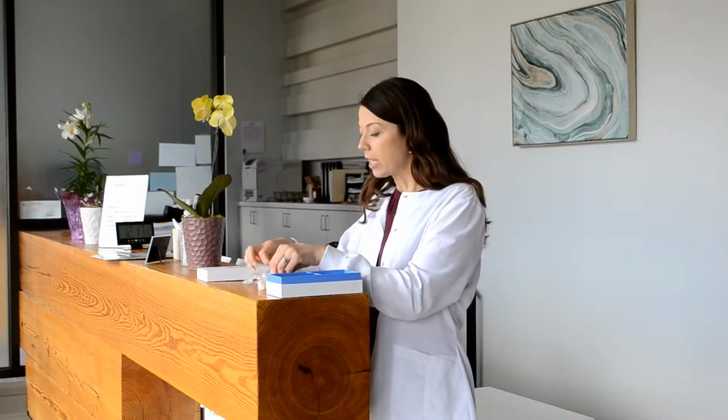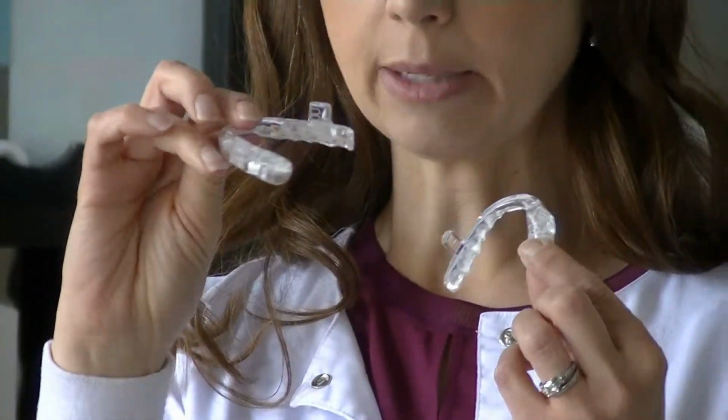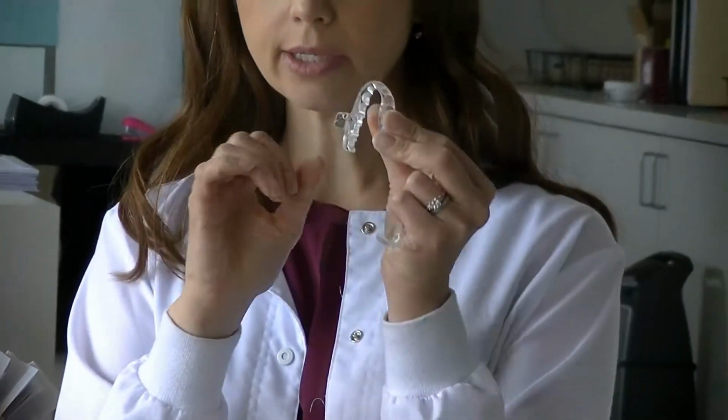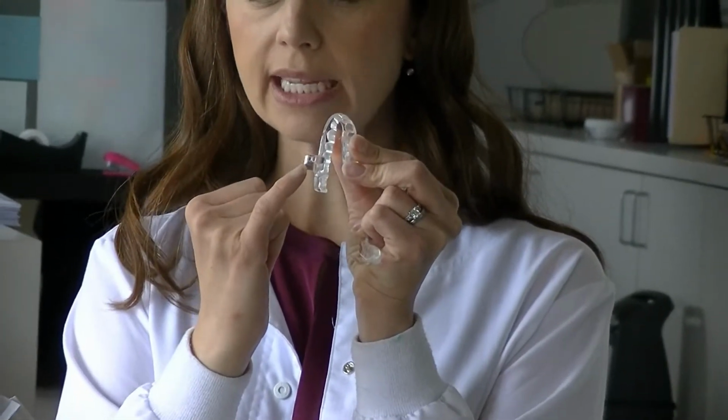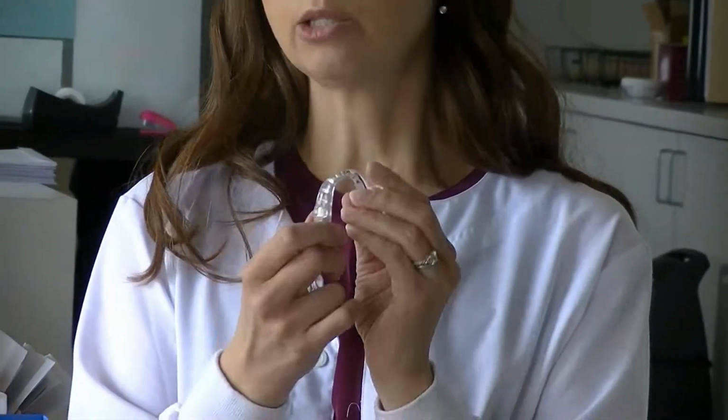The appliance itself looks like this. This is the bottom. It has little fins on the side, and then this is the top. They look very, very similar. How we tell the difference is on this side, you'll notice really, really fine print. It says U0. That means upper 0. And then on this one, it says L0, and that means lower 0.